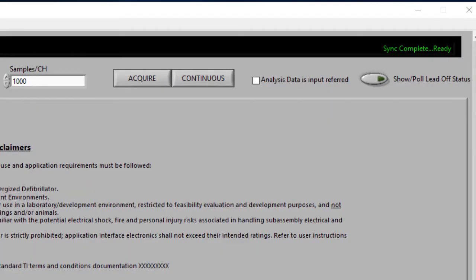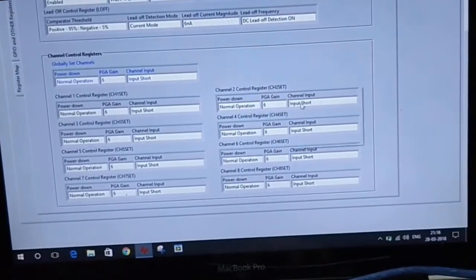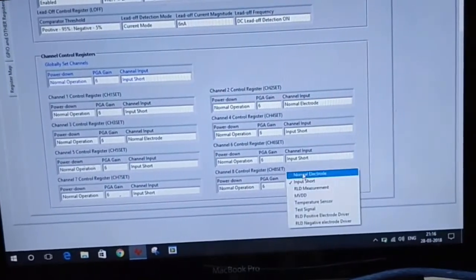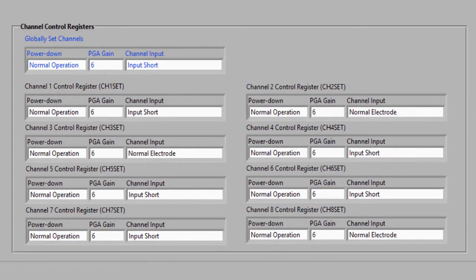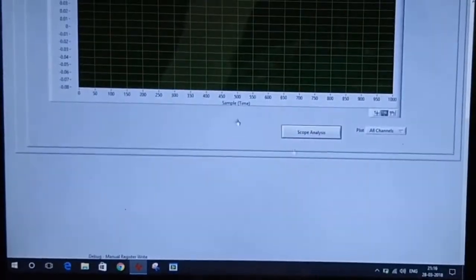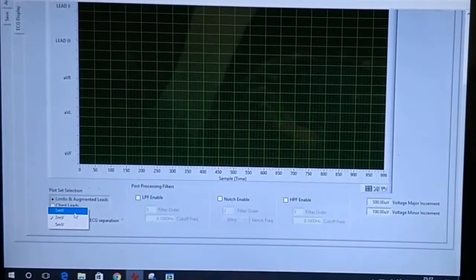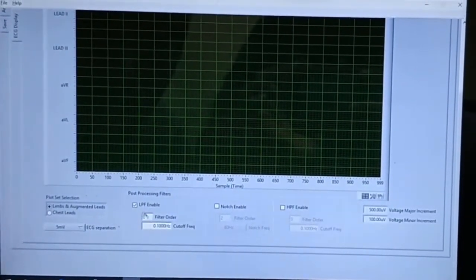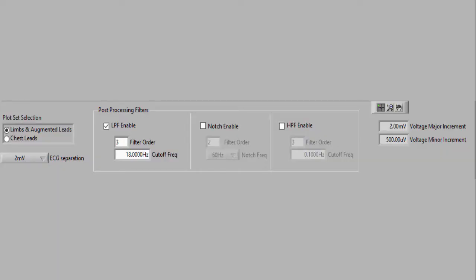Once the message 'sync complete, ready' is displayed, the channel control registers of channels 2, 3, and 8 — corresponding to the left arm, right arm, and right leg — are set to normal electrode mode, whereas all other unused channel registers are set to input short mode. The display tab of the software is then chosen, under which the ECG display tab is selected. To filter out noise signals, the low pass filter is enabled, setting the cutoff frequency to 18Hz with a filter order of 3.